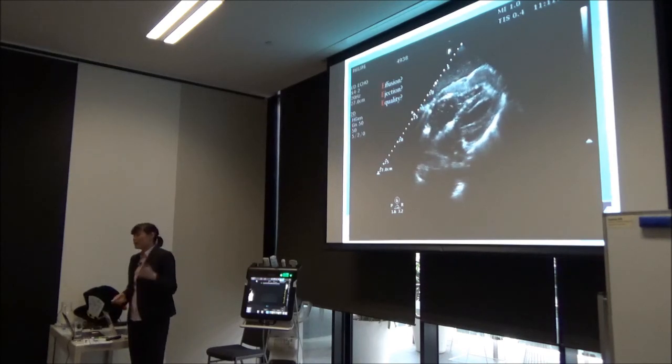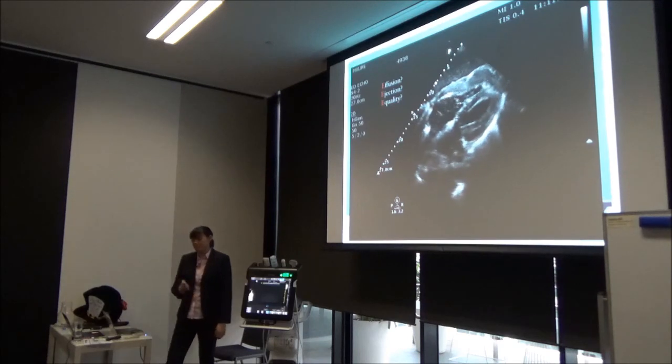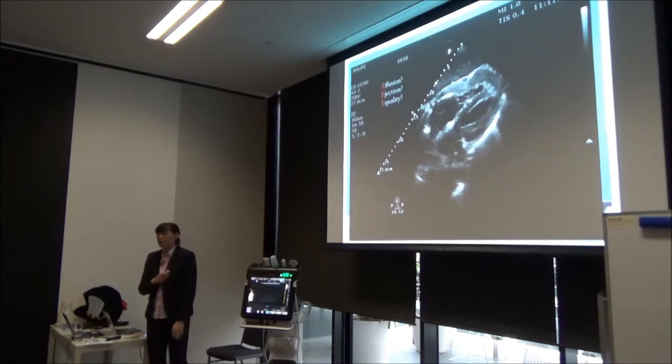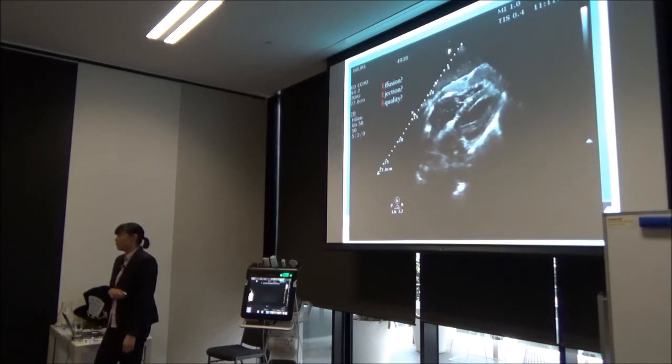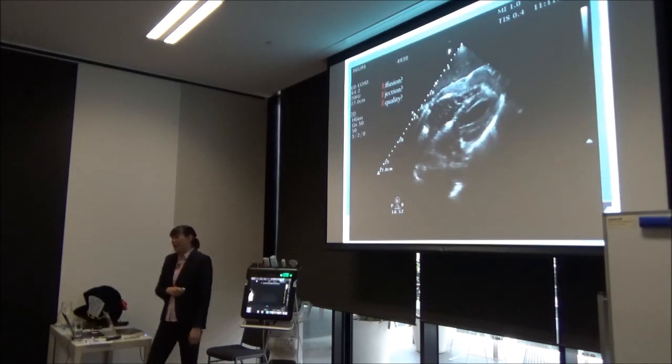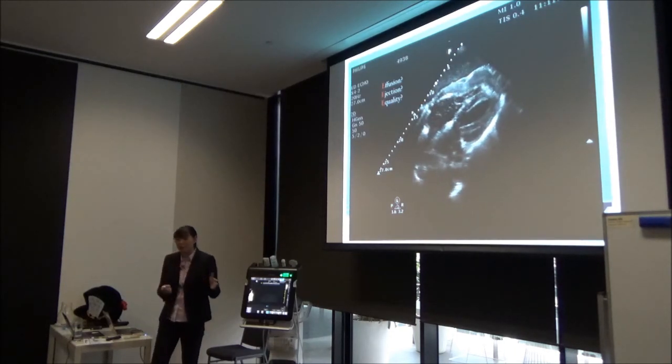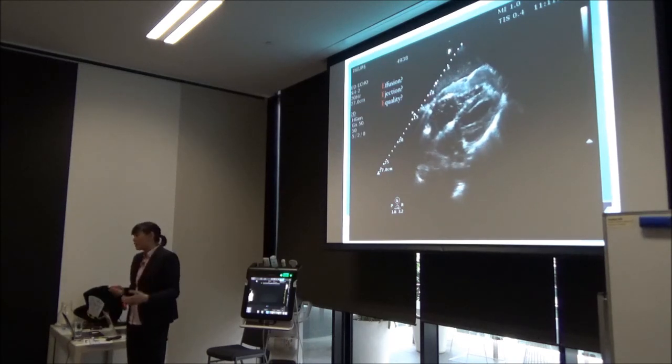Exit we can't tell, and entrance we can't tell because this isn't the right view. What do you think we're going to do from here? Should we call it, or should we continue? What else do we have besides those 5 E's that we mentioned? Yeah. So this would be FIB, this is shock, right? So I vote for continuing ACLS.